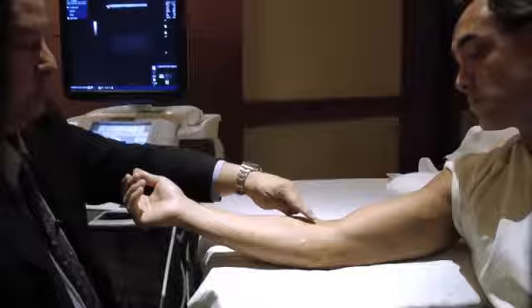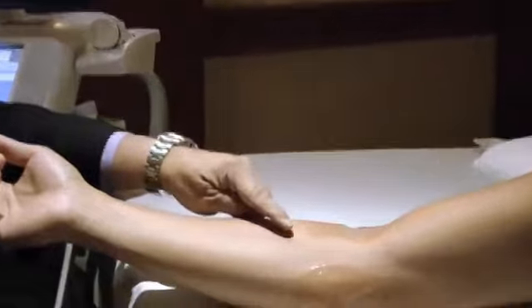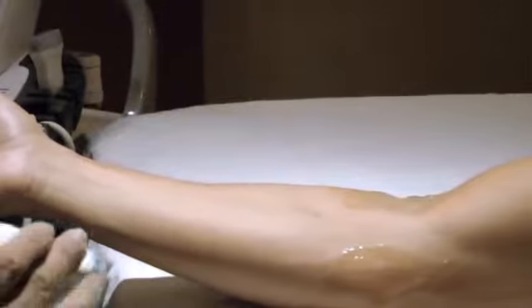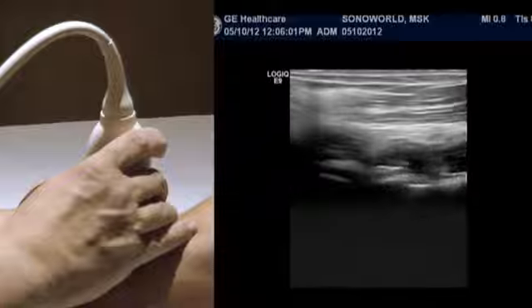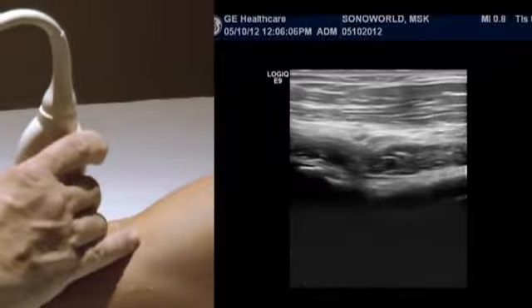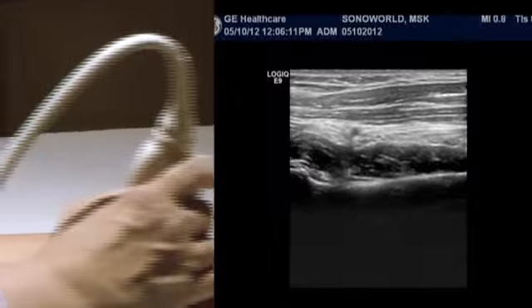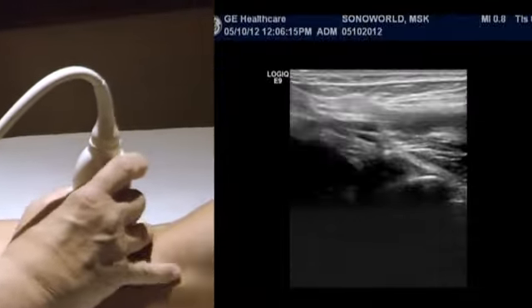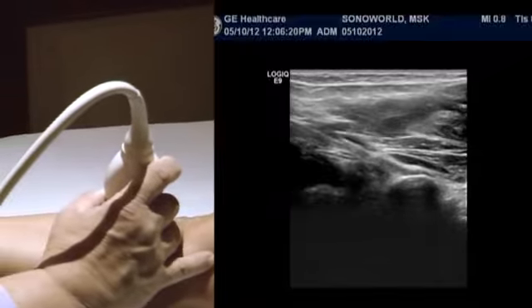The anterior quadrant dynamic imaging of the elbow will entail looking at the distal biceps tendon. A lot of people look at it in the long axis view. They identify the distal biceps tendon by taking a look at the radiocapitellar joint, move over to the radial neck and then the radial tubercle. Then they ask the patient to hypersupinate by turning his thumb down. Then the examiner moves the transducer to the medial aspect to identify the radial tubercle.